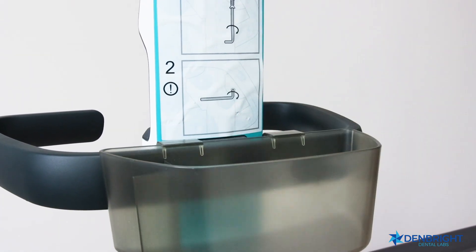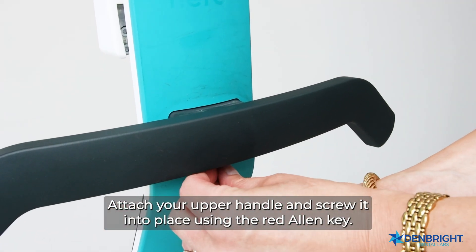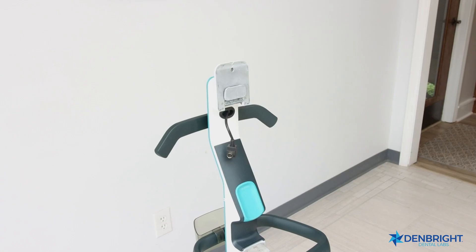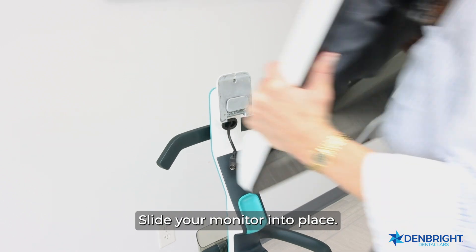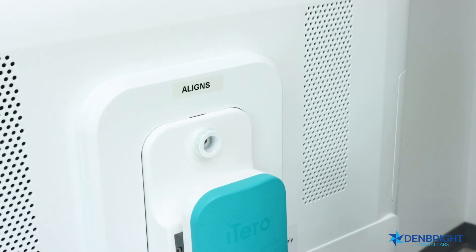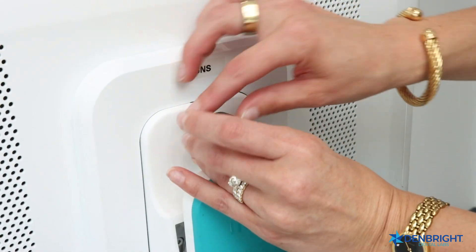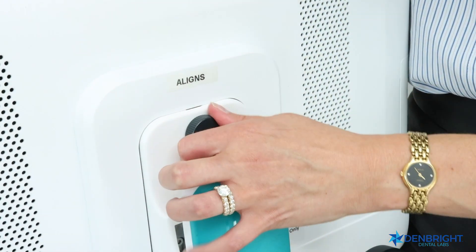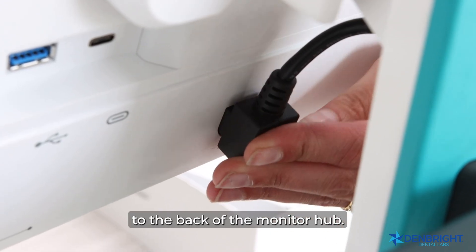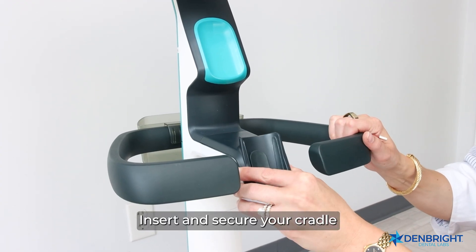Attach your upper handle and screw it into place using the red Allen key. Slide your monitor into place. Ensure your spring and screw are secured into place, then connect your cable to the back of the monitor.